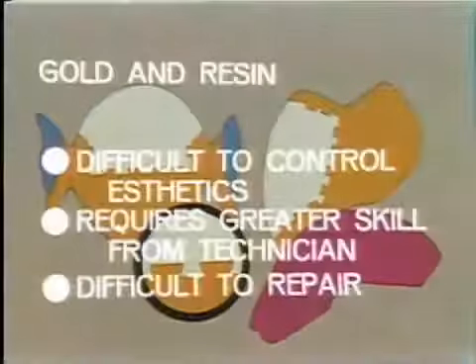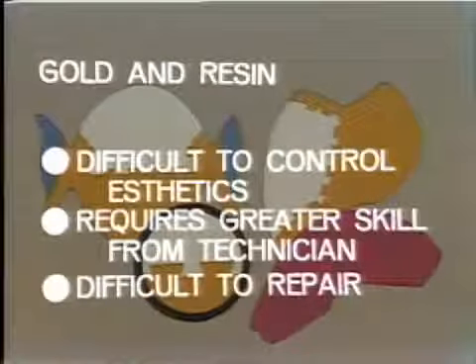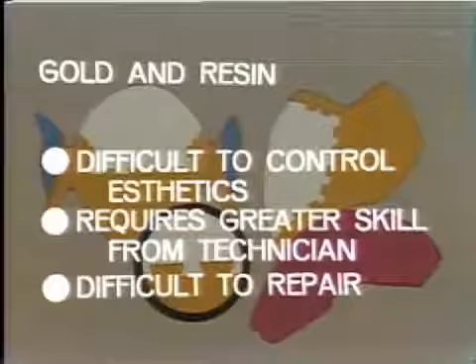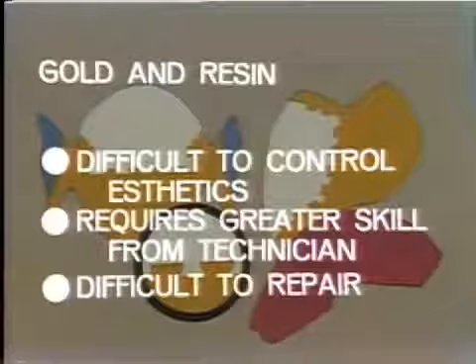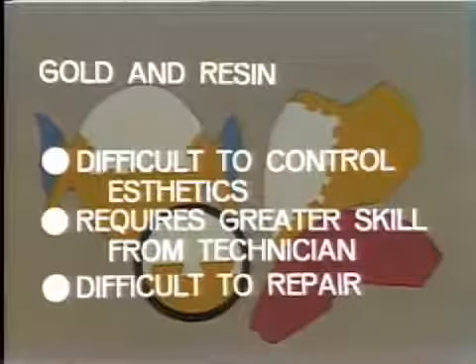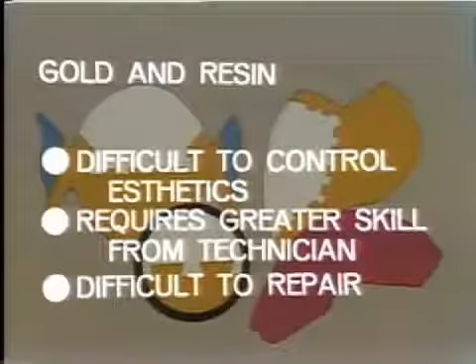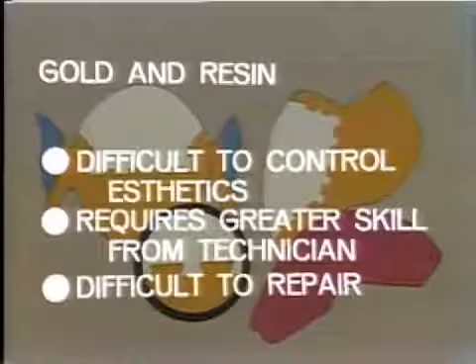Just to summarize the main points then of the gold and resin Pontic, as with all types of Pontic in which you do not use a preformed facing, it's difficult to control aesthetics, which you do not see really until the bridge is completed, when it's perhaps a little late to make any significant changes. Because of this, it requires great skill on the part of the technician in the development of the correct mold and color form, and it requires good communication between the clinician and his technician. Should these Pontics wear or fracture or break out in any way, they are difficult to repair and often require the removal of the bridge to effect a satisfactory repair.